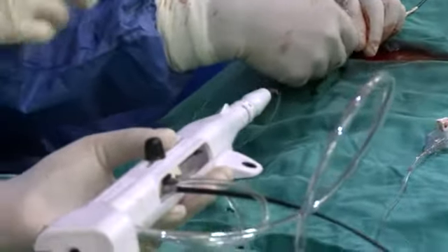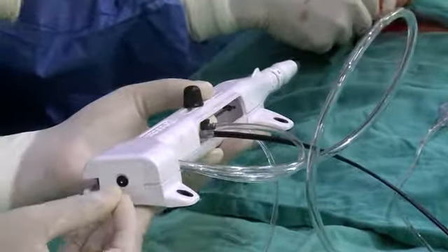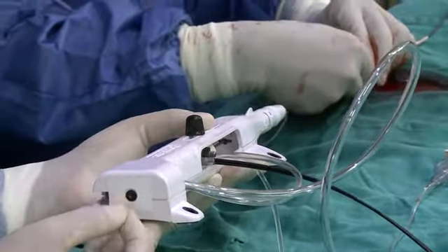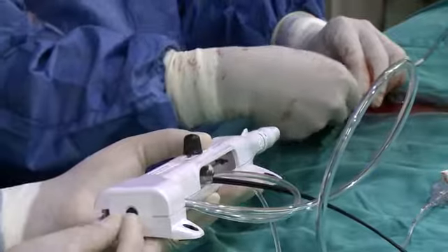So you see the burr which is coming to the aorta. We are almost there.